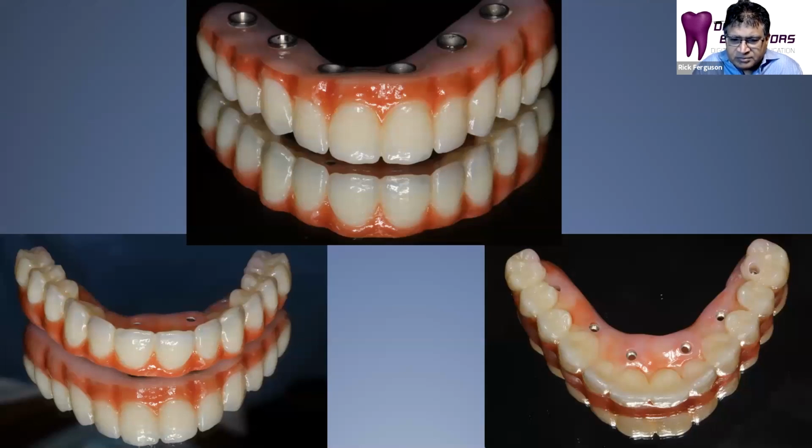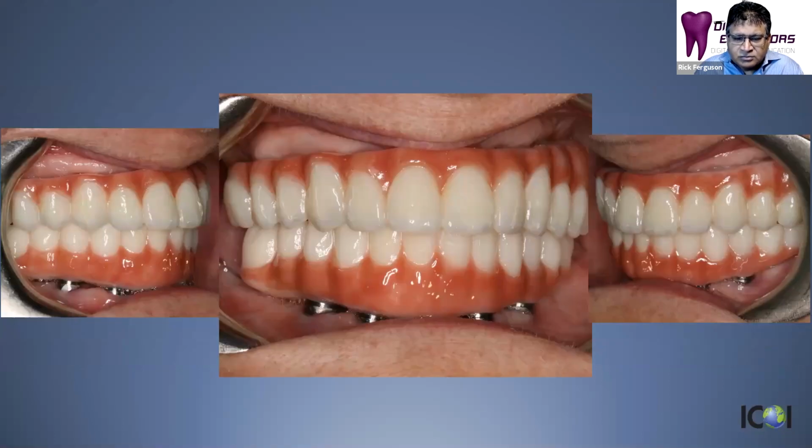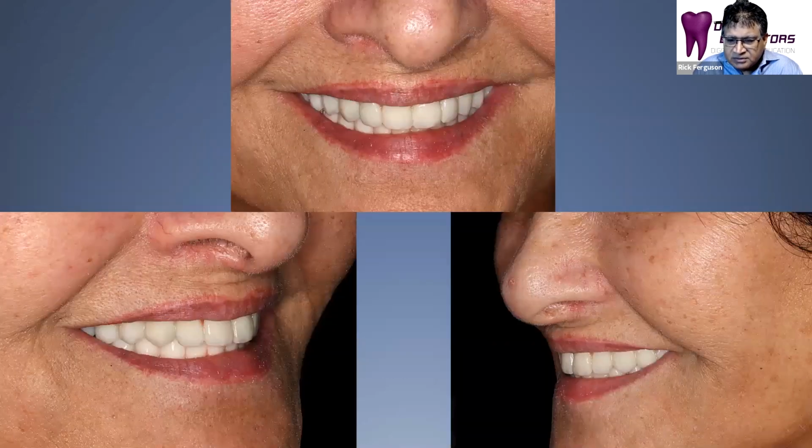So Dr. Palti was mentioning earlier before I started the webinar that his practice is metal free. So they're doing a similar workflow using full arch zirconia with their in-house mill. Now we're not doing in-house milling for full arch cases, but we will send the information to the laboratory so that they can do the final restorations. And here is the lower. And here's what it looks like after it's been placed in the mouth and fixated. And here's the patient's final smile.